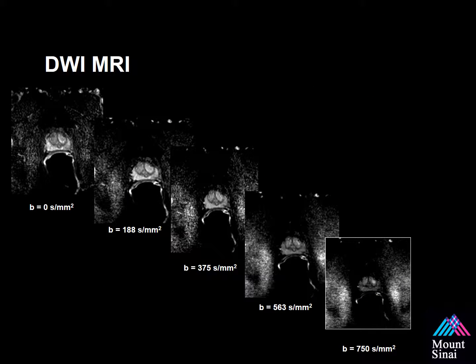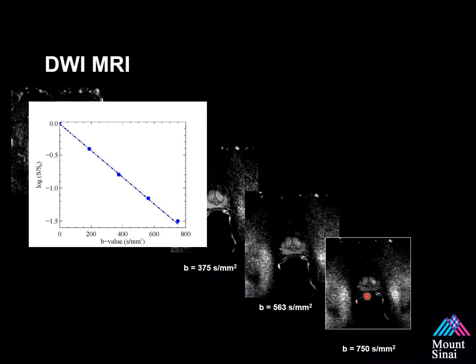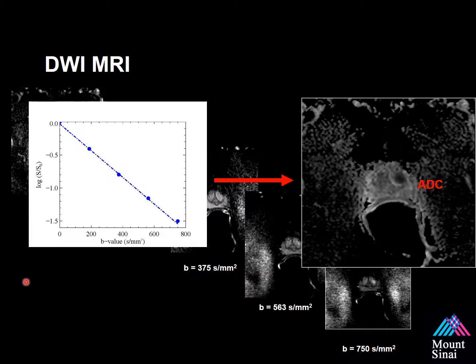This is an example of diffusion-weighted imaging with different B-values: 0, 188, 375, 563, and 750. At B0, this is essentially the T2-weighted imaging. As you increase the B-value, notice how the signal or brightness of the image decreases — except for one area. See this area right above my pointer? That stays bright the whole time. That is an area of increased restriction. An ADC value is the slope of the line created from diffusion-weighted imaging at different B-values, and an ADC map will appear as an area of low signal or dark spot that you can review.